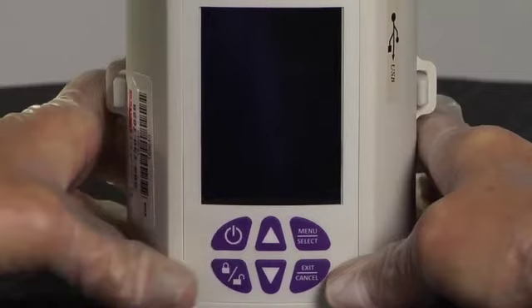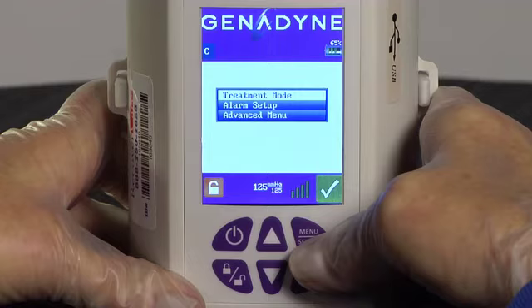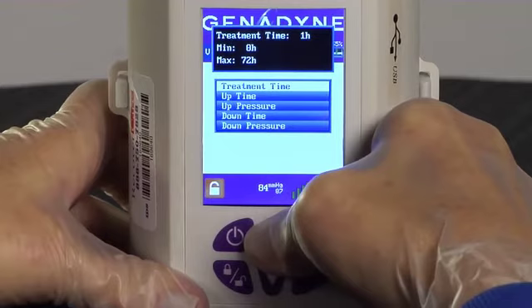To program Variable Therapy Mode, turn the pump on by pushing and releasing the on-off button. Press the Menu Select button and the menu will appear. Use the Up or Down button and choose the Treatment Mode function by pressing the Menu Select button once. Select the Variable Mode by using the Up or Down button and press the Menu Select button. Now scroll through the menu to set the Treatment Time and push the Menu Select button. Using the Up or Down button, set a Treatment Time, then press the Menu Select button to save the setting.